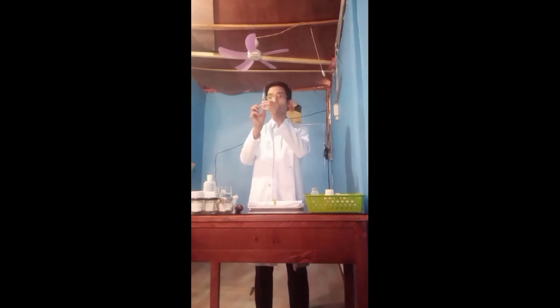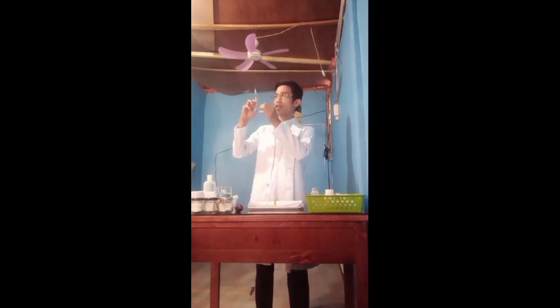Next is to keep the needle tip under the surface of the liquid. So tip the ampule to bring all fluid within reach of the needle. So I have here the 0.5. Oops.